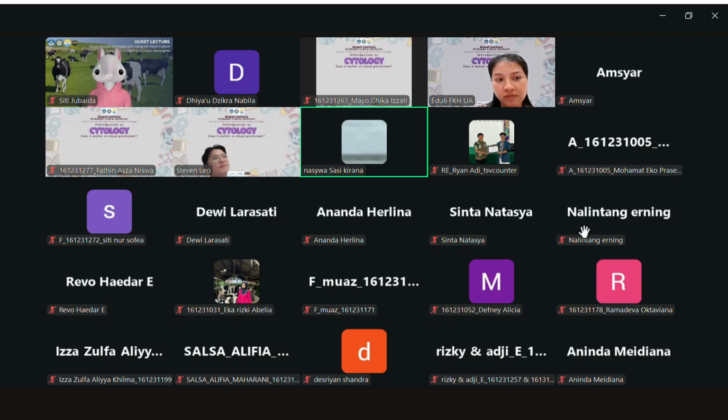So I'm still confused how to tell the difference between melanoma and mast cell, and does the color of the preparat actually influence the difference?